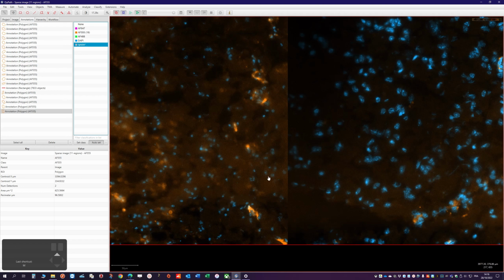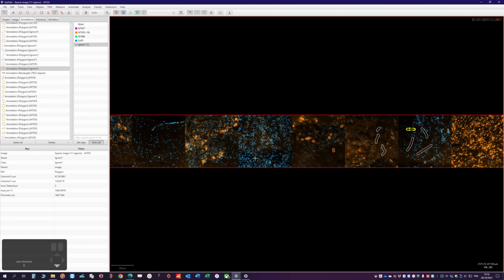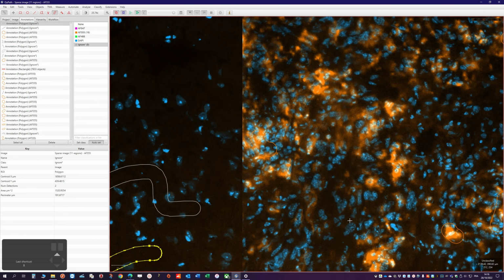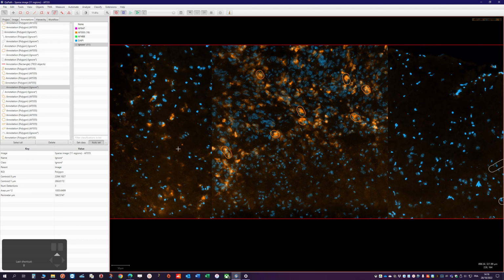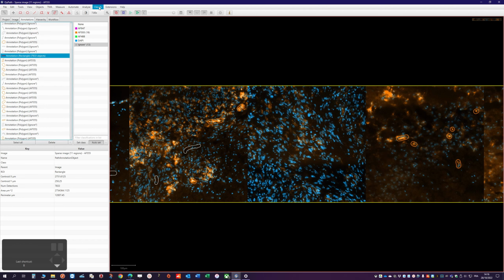Let's switch to the ignore brush, because you get the idea. This is background, and I think here it's quite useful to select a few more. Like that. Okay, so how does it look?